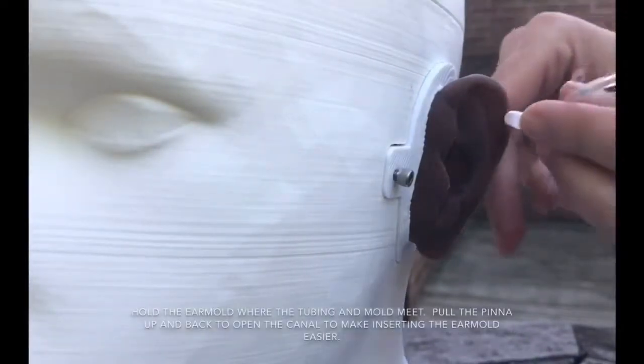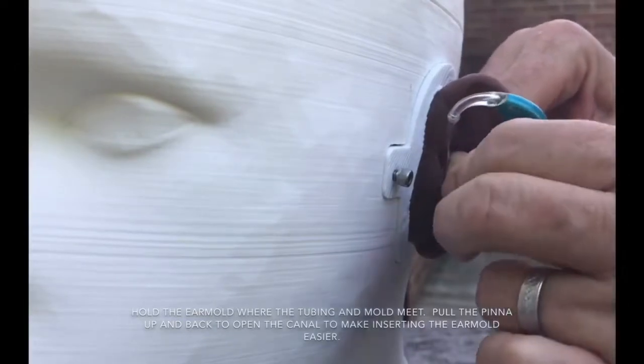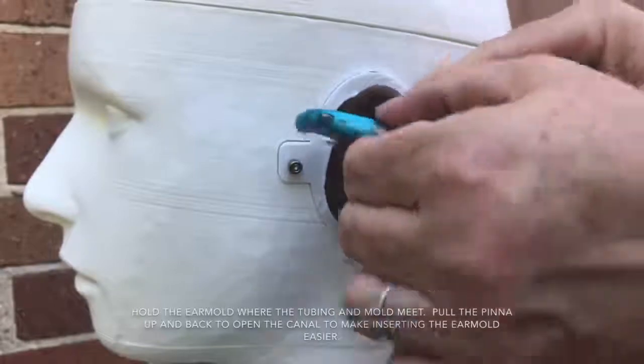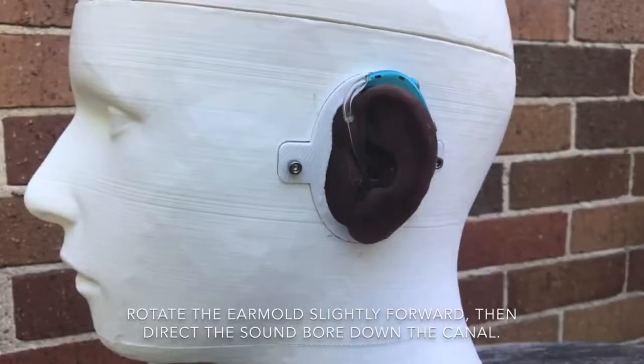Hold the ear mold where the tubing and the mold meet. Pull the pinna up and back to open the canal to make inserting the ear mold easier. Rotate the ear mold slightly forward, then direct the sound bore down the canal.